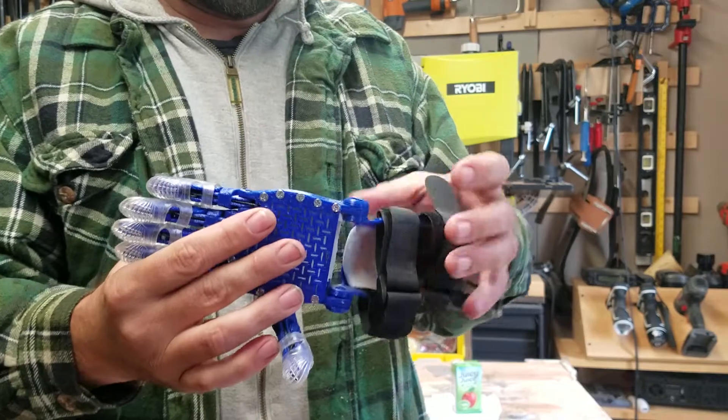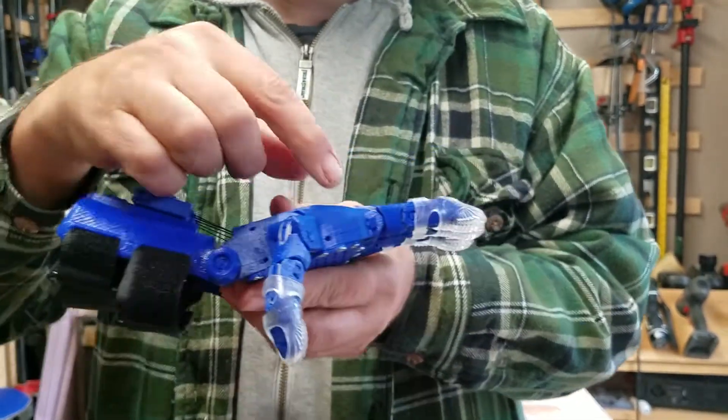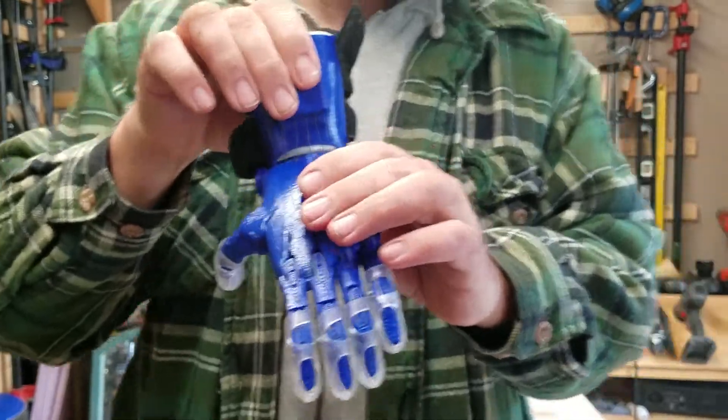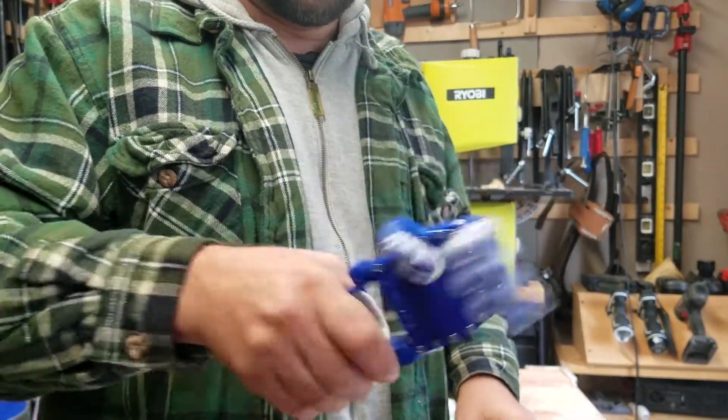I'm going to show the pins — pin one, pin two, hand pin, and finger pin — in good shape, showing that nothing pops off.